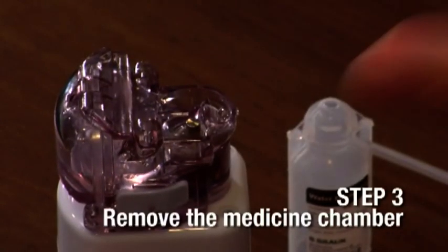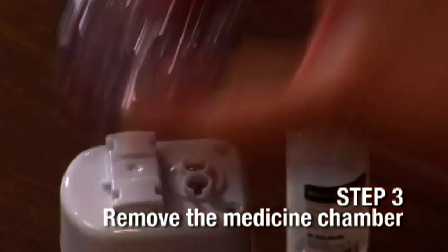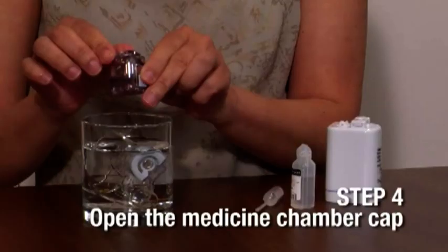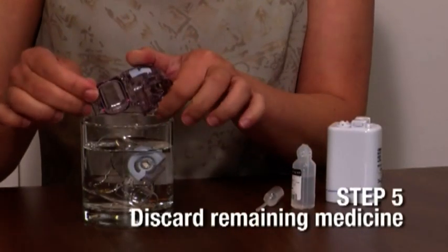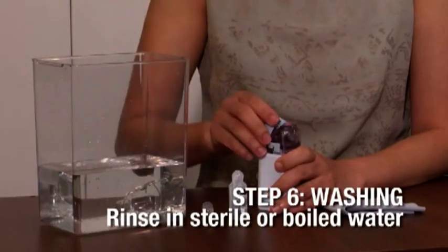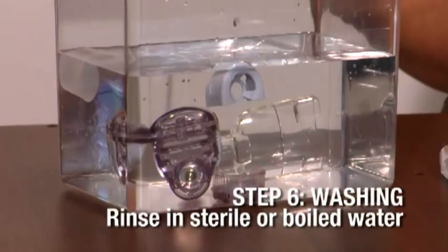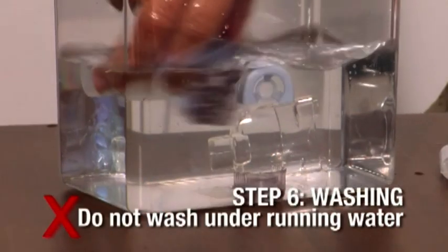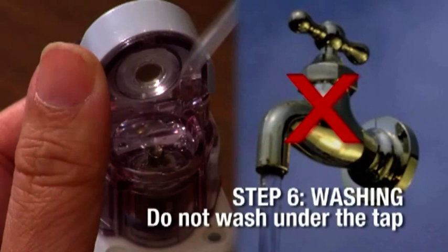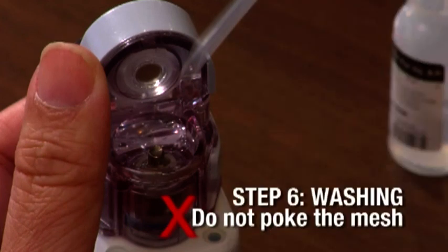Disengage the medicine chamber from the base unit by pressing firmly on the two buttons on the side of the chamber and lifting firmly up. Disengage the medicine chamber cap lock and open it. Discard any remaining medicine. Have a clean container filled with sterile or boiled water and rinse these items in the container. Carefully rinse the mesh cover — do not insert your finger into the mesh cover or wash it under running water, as it will get damaged. Do not wash any items under the tap, and do not brush the mesh with a toothbrush or similar items.